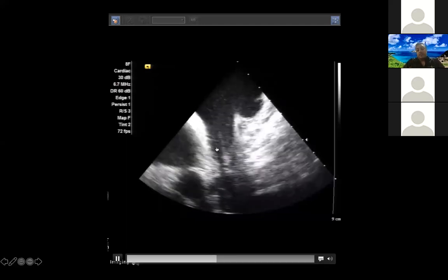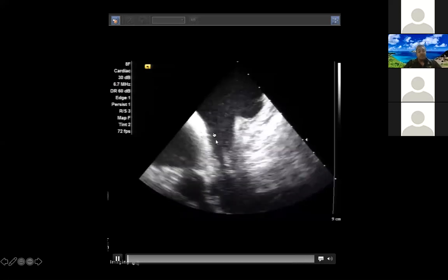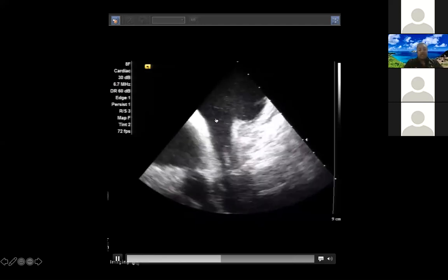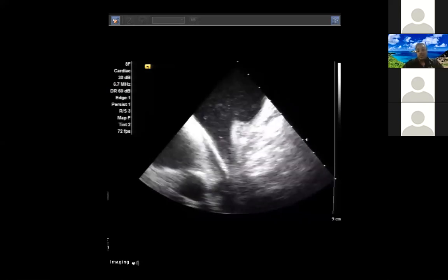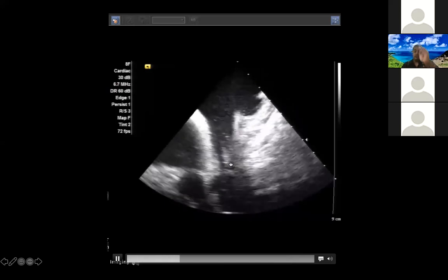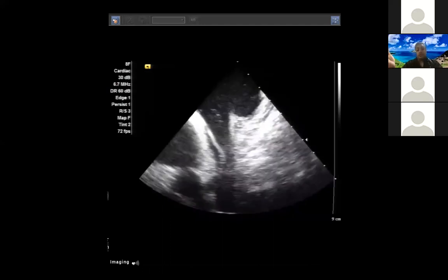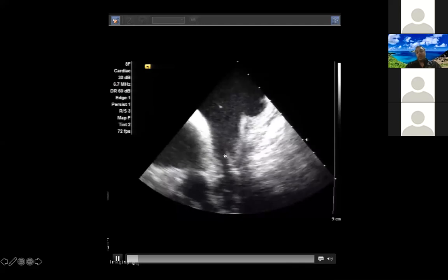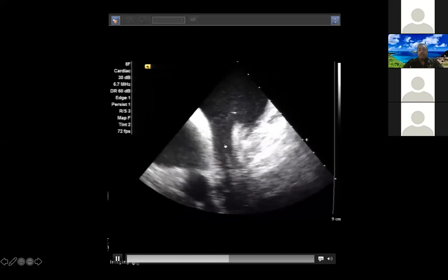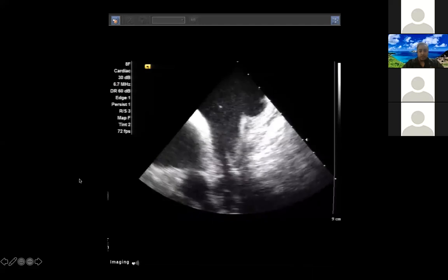So there are different ways around this if you are having difficulty. One thing you can do is put the long sheath in just a little bit, then take your ablation catheter through the long sheath, and then you can watch your ablation catheter go up on mapping into the SVC. And once you have your ablation catheter up, then you can track your sheath over the ablation catheter, and then you actually don't even need a wire, right? So there are different ways of doing this. I will say 9 times out of 10, you come up from the groin, you have this view, you'll see your wire show up. If it doesn't show up, take a step back and come up with another approach.